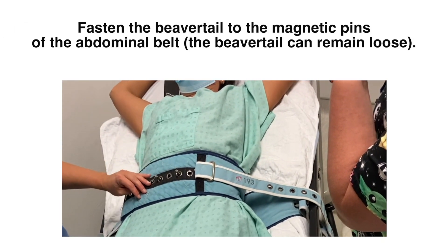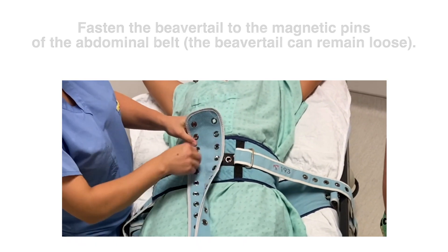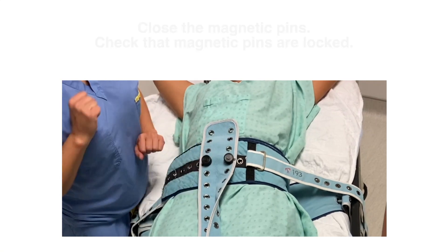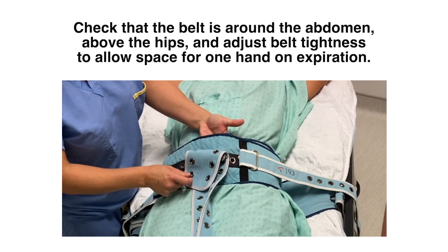Fasten the beaver tail to the magnetic pins of the abdominal belt while leaving the beaver tail loose. Close the magnetic pins and verify that they are locked. Check that the belt is around the abdomen, then adjust the belt's tightness to allow space for one hand on expiration.